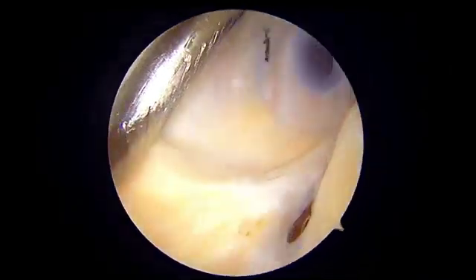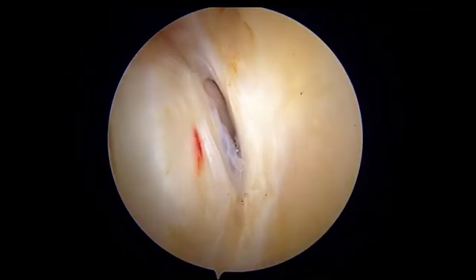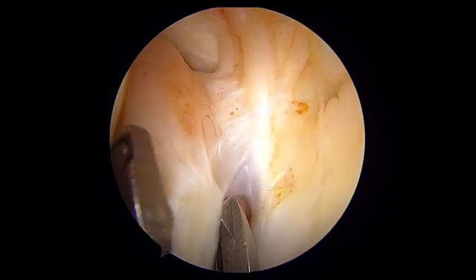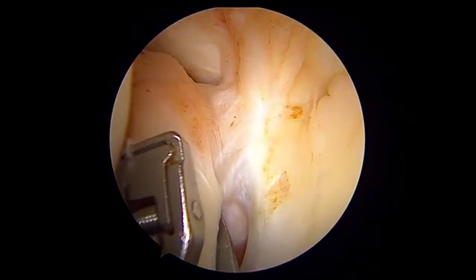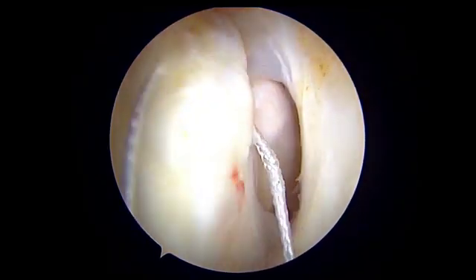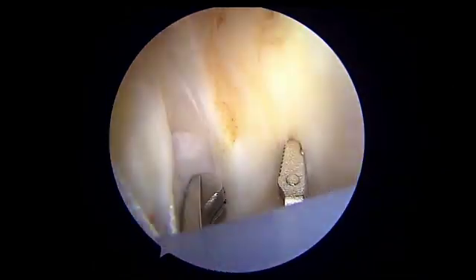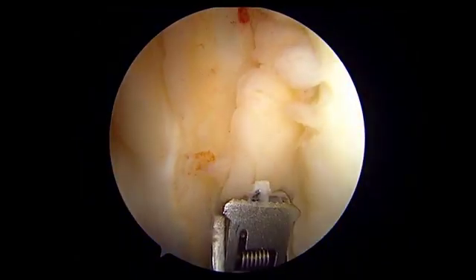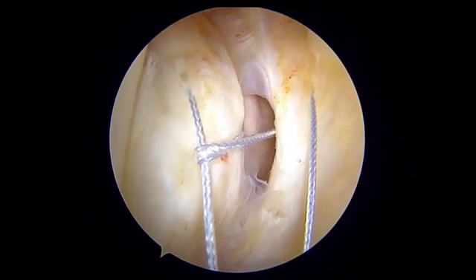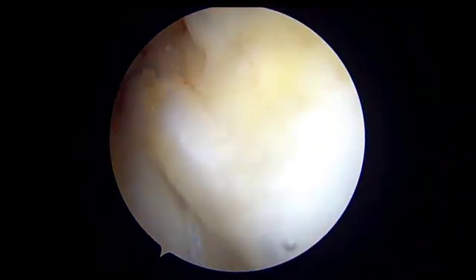We are now shifting our vision to the high posteromedial portal. Looking from the high posteromedial portal, the instrument is coming from the low posteromedial portal. Probing is done from the low posteromedial portal, and now using an antegrade suture device — a knee scorpion with FiberWire loaded onto it — the first bite is taken through the meniscus. The suture is loaded again and the bite is taken from the posterior leaf of the ramp. The suture is then passed for tying onto both limbs. Suture tangling can be managed by putting a suture manipulator from the anterolateral portal, and both sutures are taken out through the anterolateral portal.